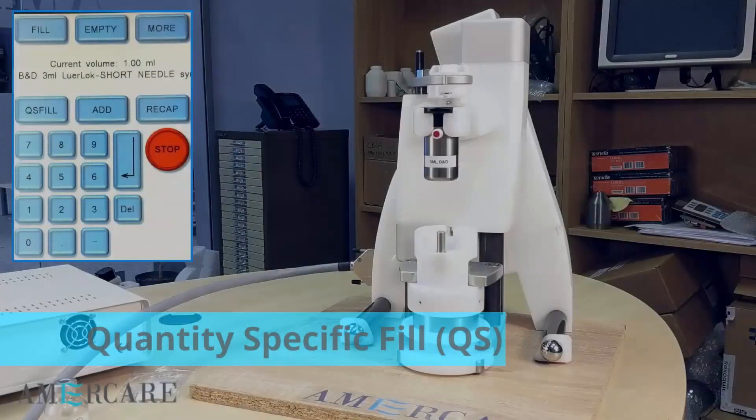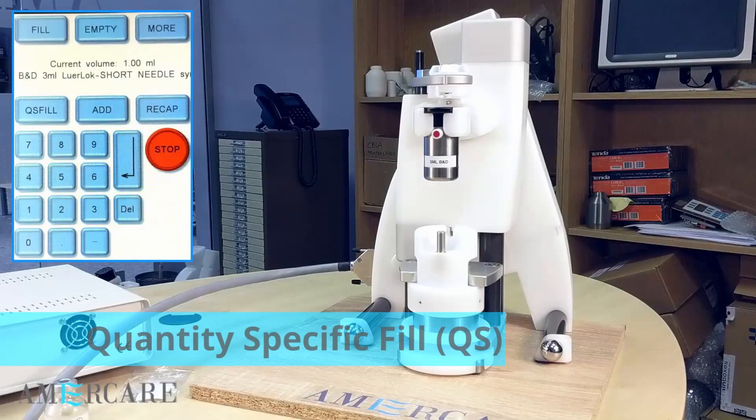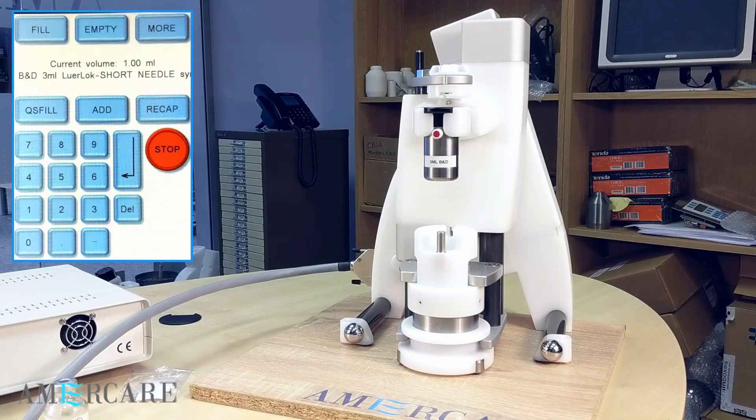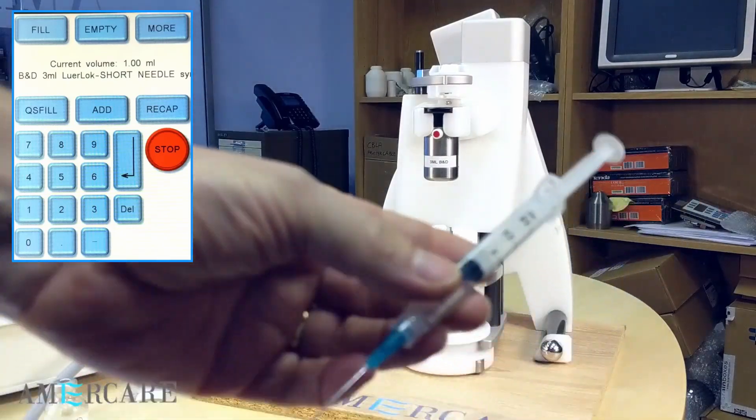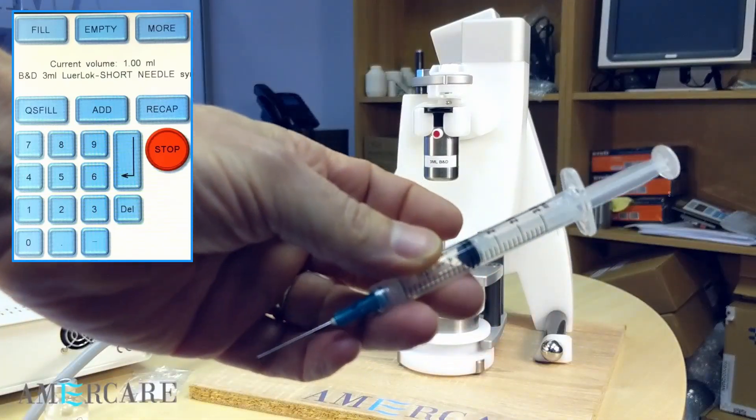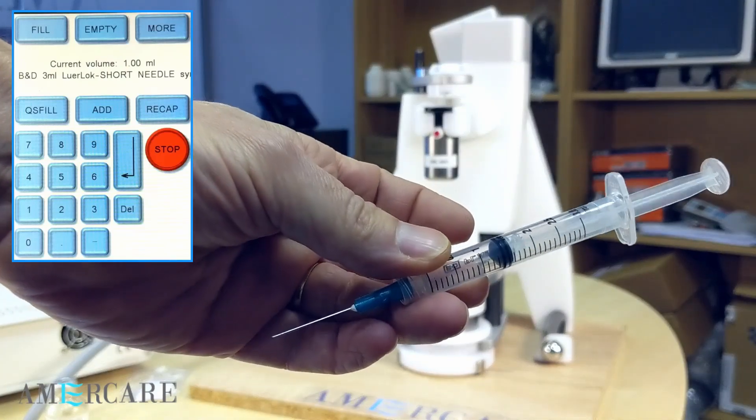Quantity specific or QS fill. This function allows the unit to add product to a pre-filled syringe. For example, we can pre-fill a syringe with 1.5 milliliters of saline ready to add product.